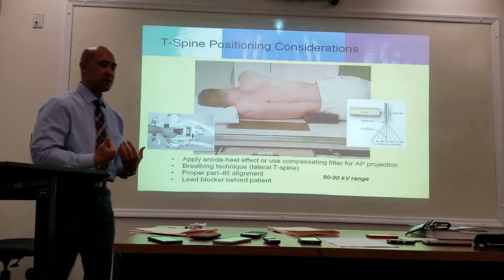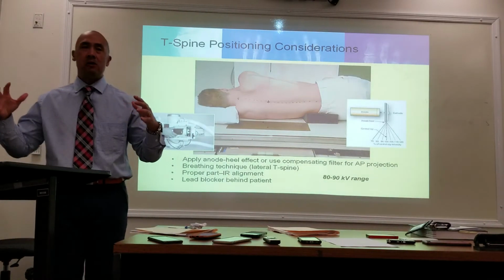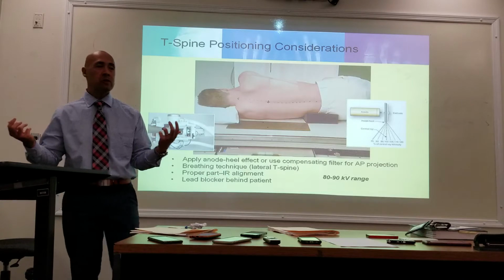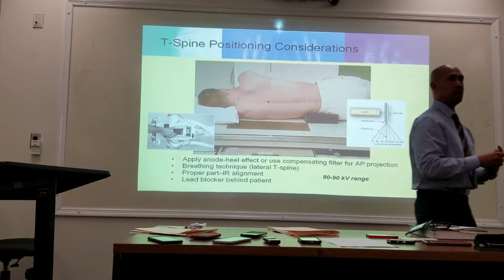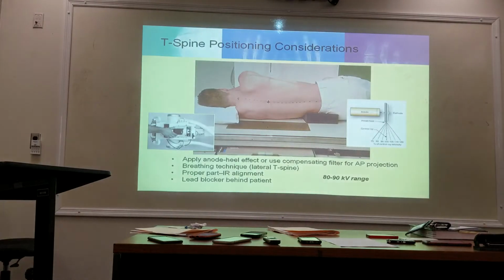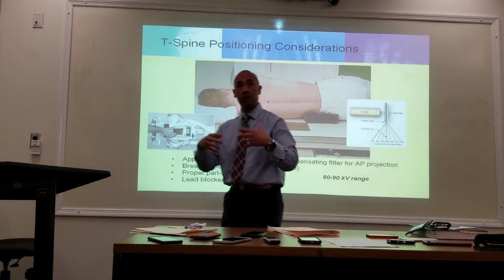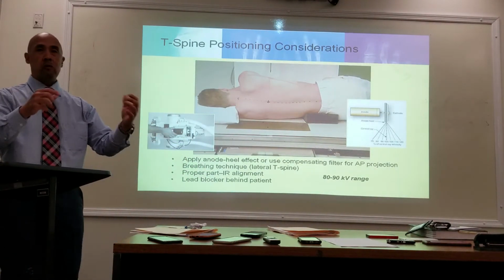Because it is thoracic spine and not a chest x-ray. Chest x-ray, you're using higher KVs. Why do we use higher KVs for the chest x-ray? For grays, more contrast. Exactly, because higher KVs means a longer scale of contrast.